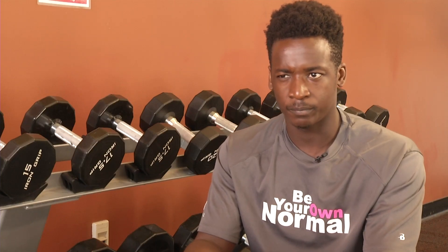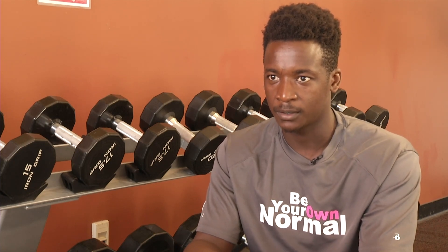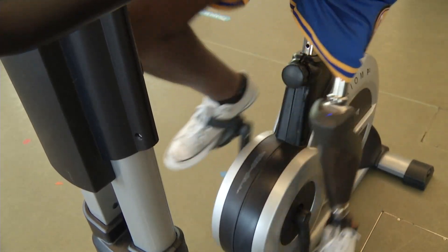This allows the patient to walk much better and much more comfortably. I have better control of my prosthetic because it's now connected to my skeletal frame.